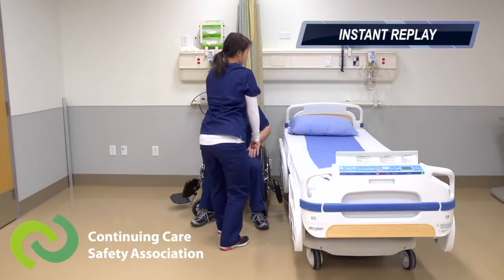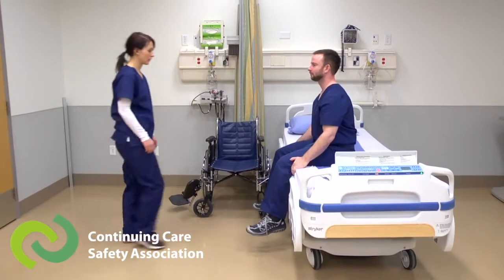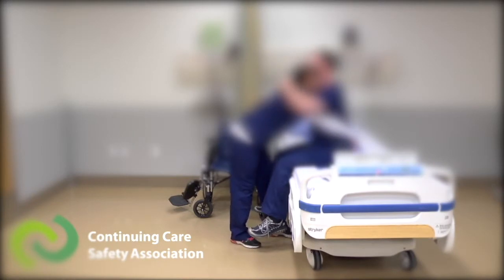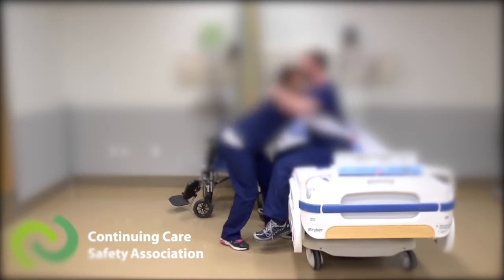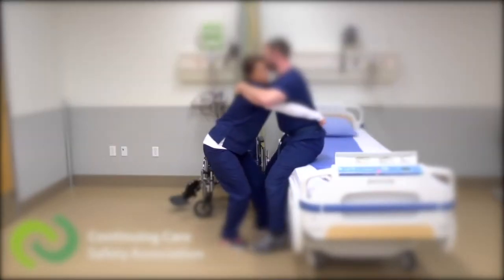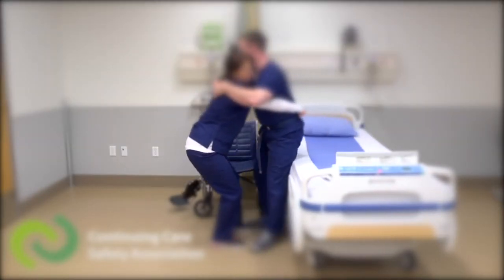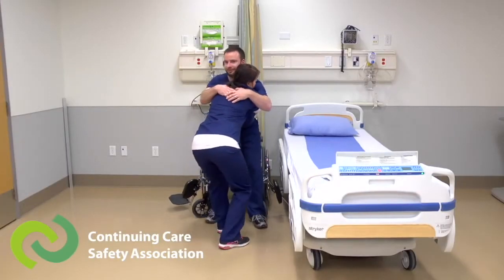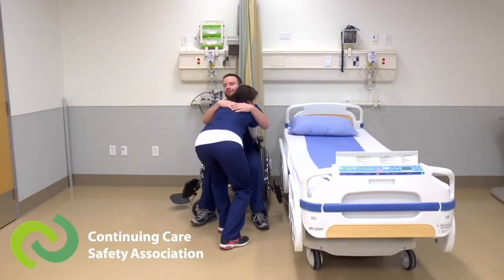Let's take a closer look. In this demonstration there are three primary concerns. First, the resident's feet are not firmly planted on the floor at the start. Two, the resident's hands are placed around the worker. And three, the worker bends at the waist when helping the resident up and down. These three things increase the risk of injury for both the worker and the resident.